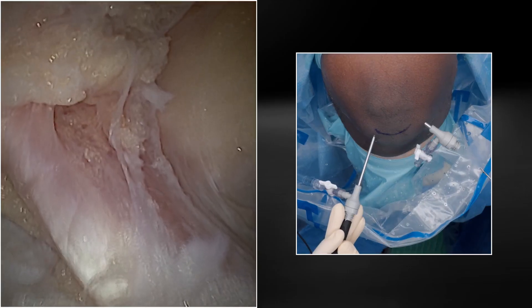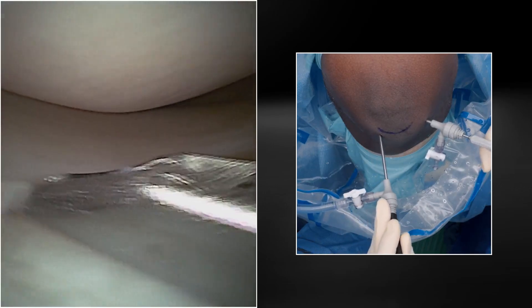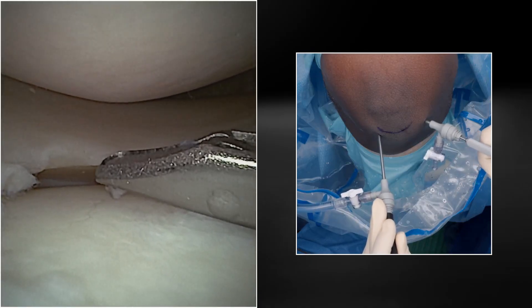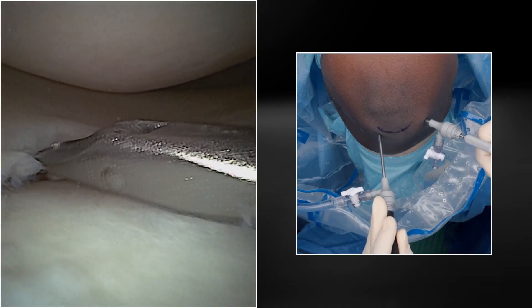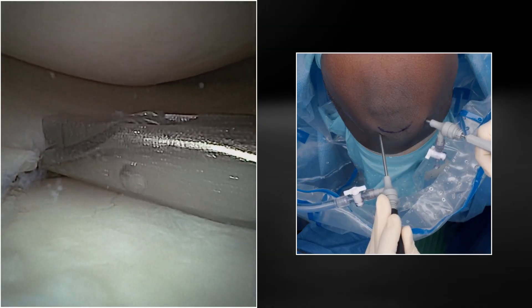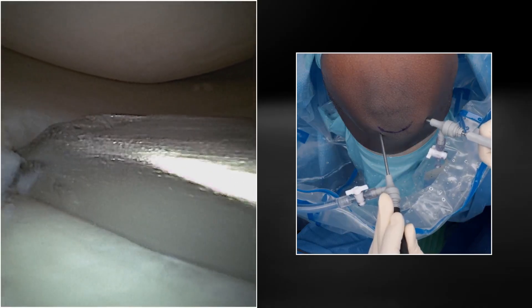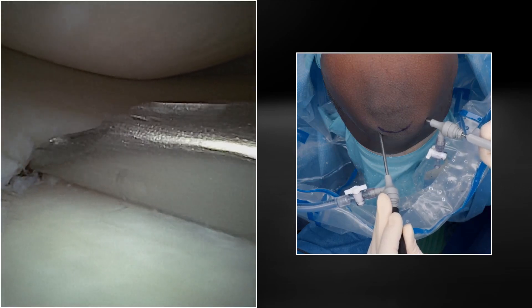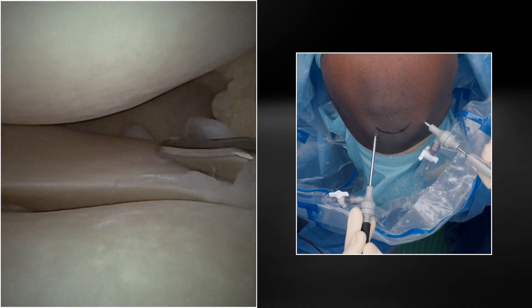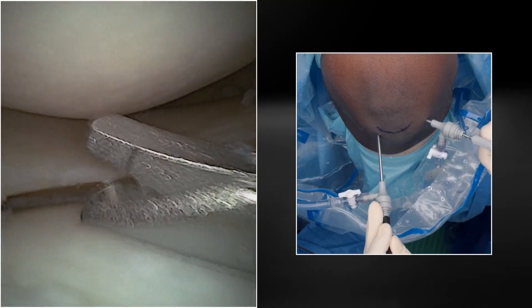Now we're going to utilize some of our nano instruments to do some meniscal debridement for that lateral meniscus radial tear we saw earlier. This is our Nano Biter — the one we spoke about earlier that you can bend and reuse. It gives you excellent control over your meniscal resection to make a really nice smooth edge. You're not accidentally plunging, and you can get your camera very close to the tissue so you can really see what you're working with. This is particularly great for those stubborn tears in the posterior root on usually the medial side — where you have a piece that's flipped up and stuck in the notch that the standard shaver and biters just keep pushing backwards. And you can see that there are teeth on this biter as well.